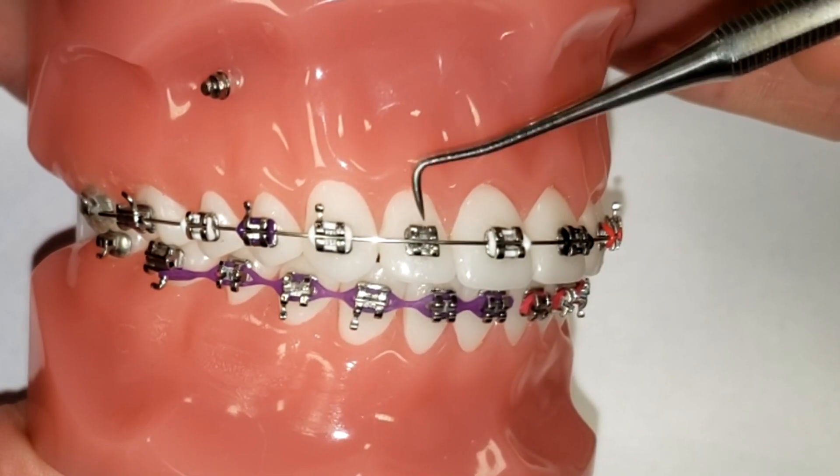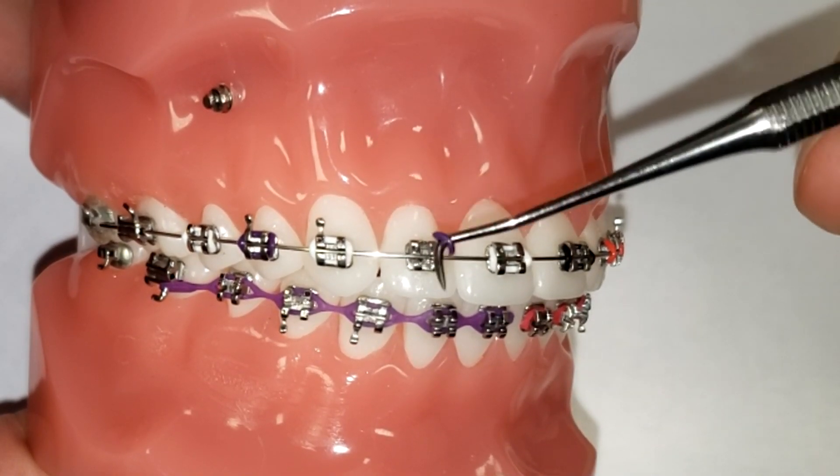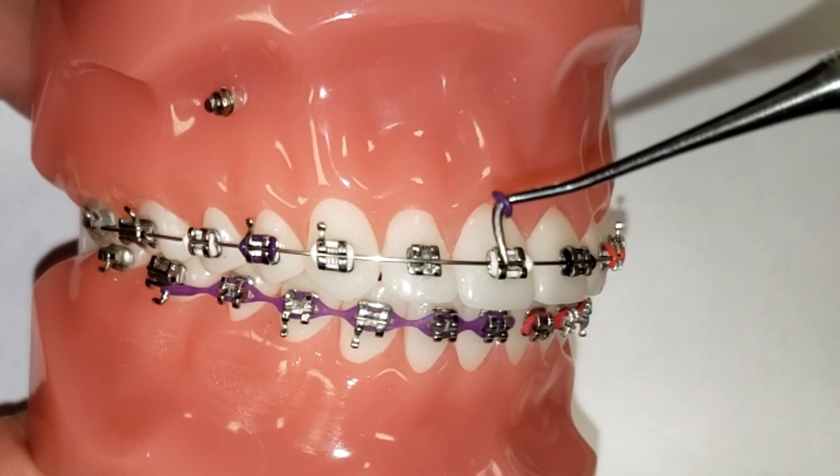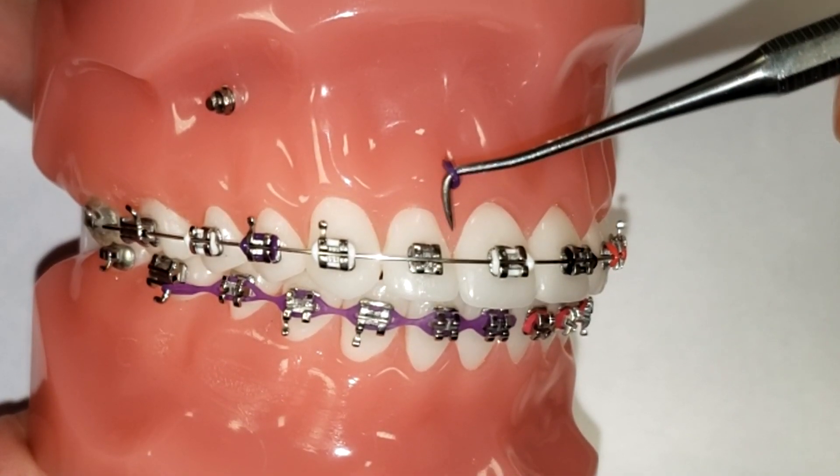So what do you do about that? Unfortunately, you're not going to be able to put the color back on. So if it's just a little single color like this, then you're probably fine. I would advise you to take a picture of it and send it to your orthodontist and ask them what to do.